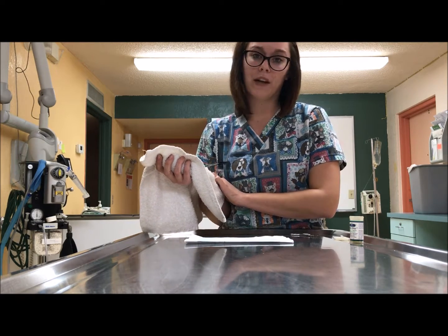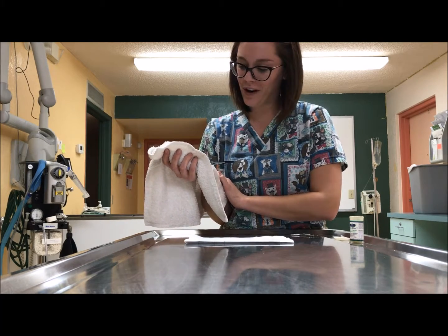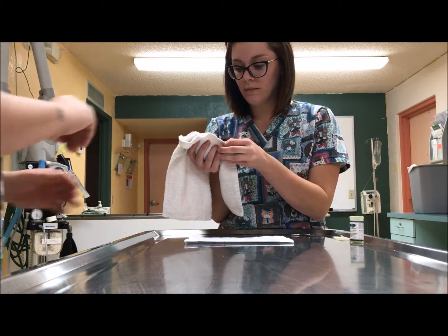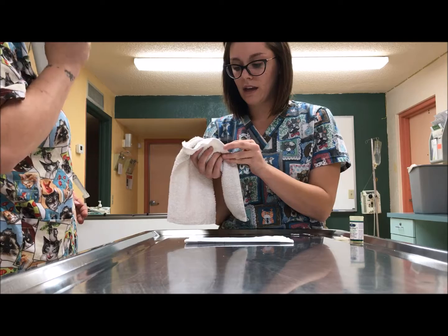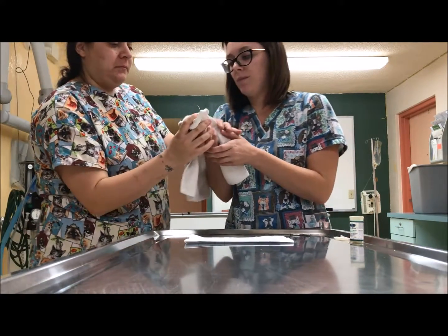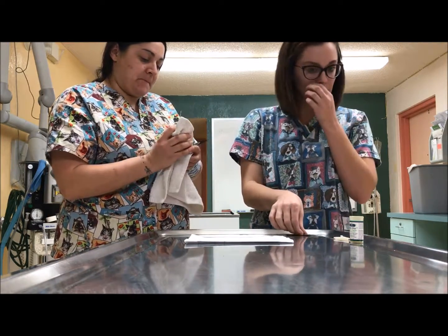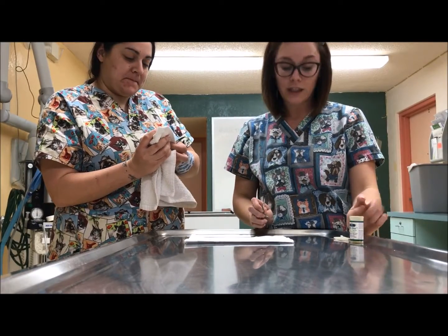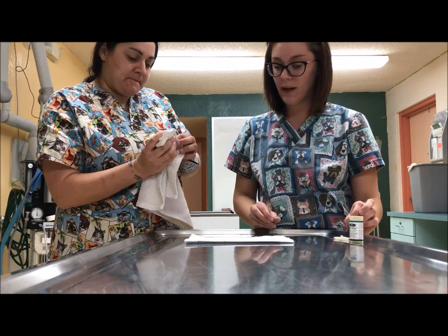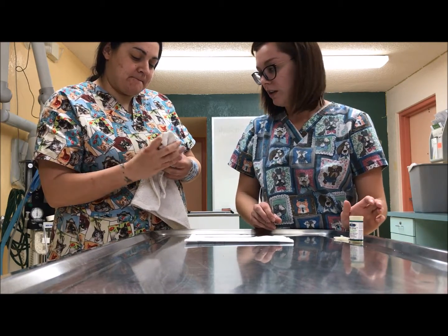And you can also, on parrots, do the Elizabethan hold, but on little birds like this guy, that doesn't really work. So now I'm going to show you how to do a nail trim on a bird. If the bird's pretty docile, you can probably do it alone, but it's always best to have someone help you out, just in case. All right, so when you're doing a nail trim, you always want to make sure you have Quick Stop handy and available, ready to go in case you accidentally quick them, because any loss of blood for birds can be a pretty big deal.